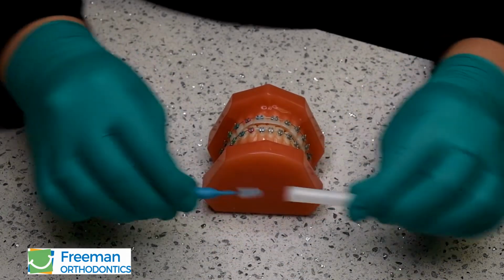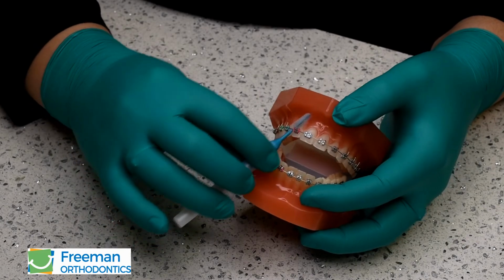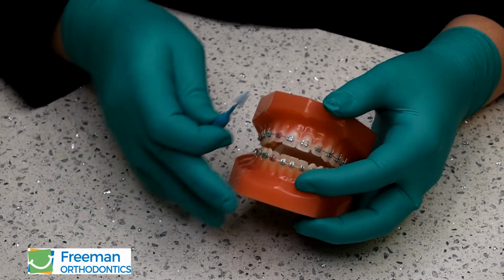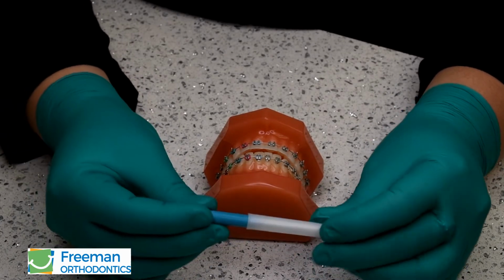A handy tool to keep with you is a proxy brush. This is a quick way to remove food that is trapped under the wire. Please note, this does not replace brushing. These are reusable. Simply rinse them off and replace the cap.